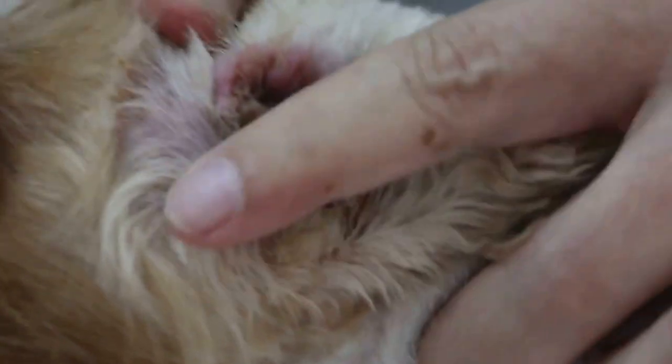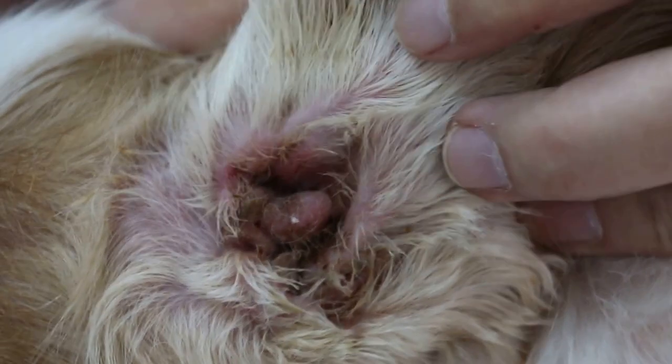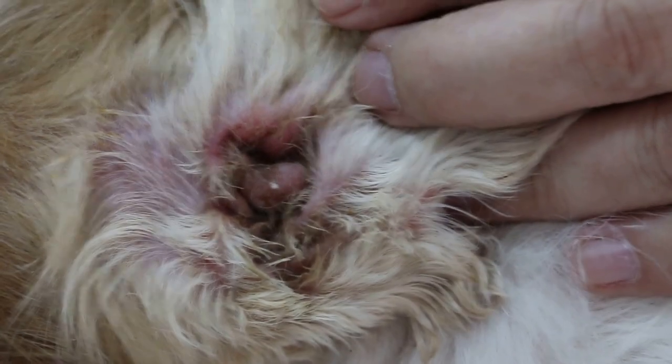This is a good example of before the operation. So I will ask Nicholas to take several pre-op photos of it.